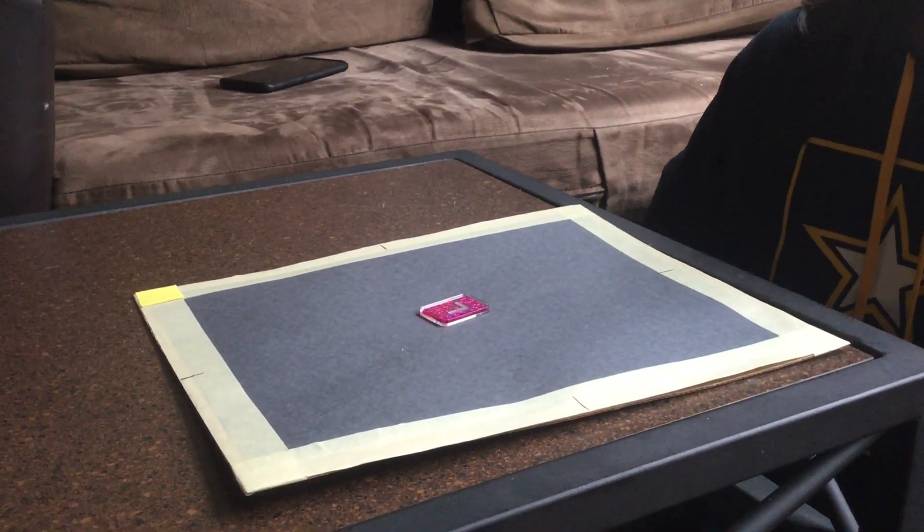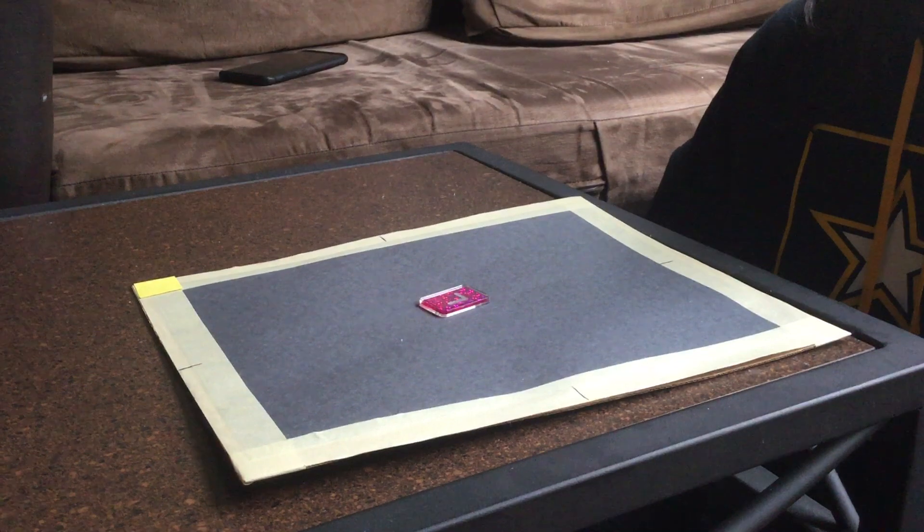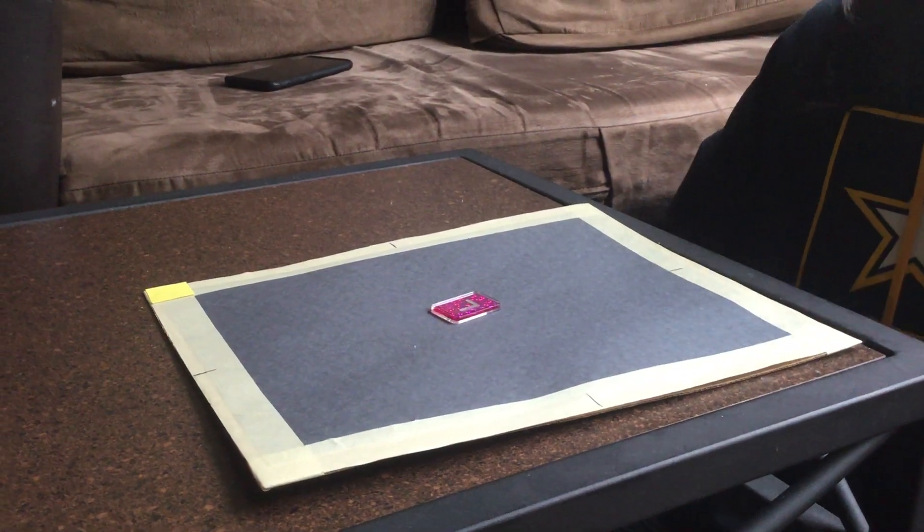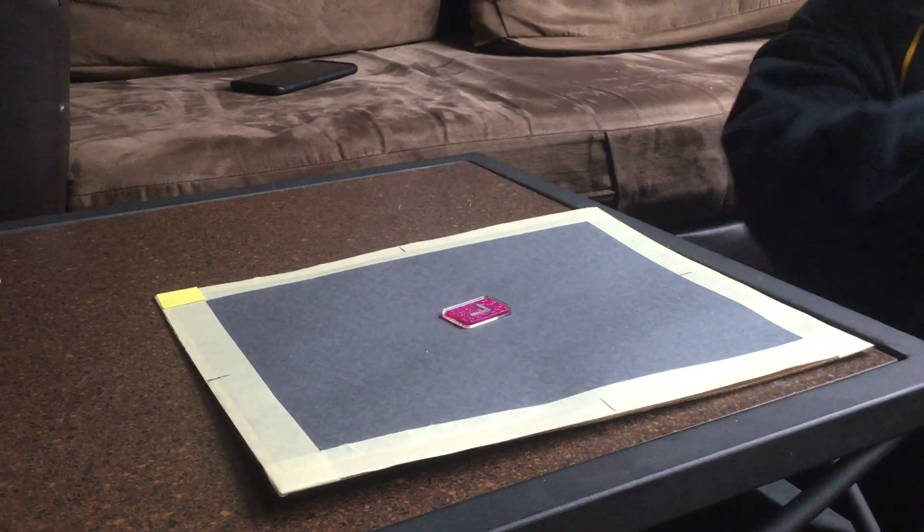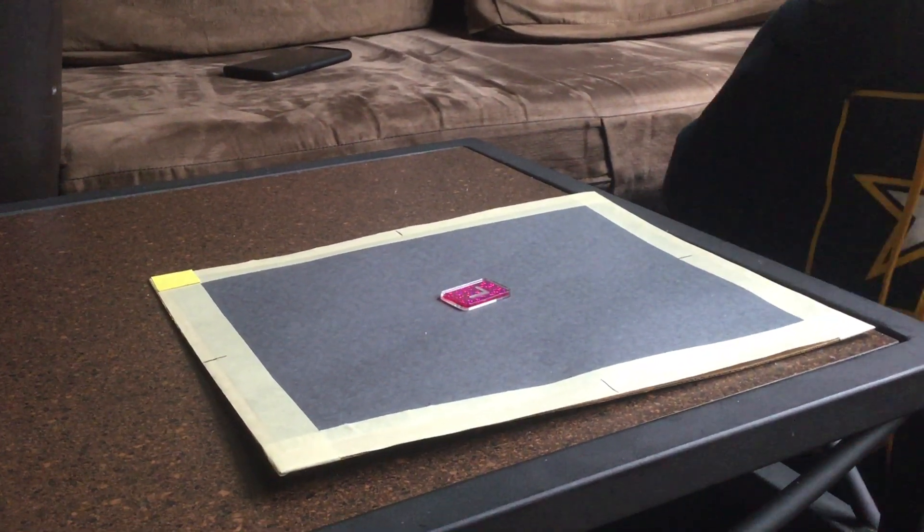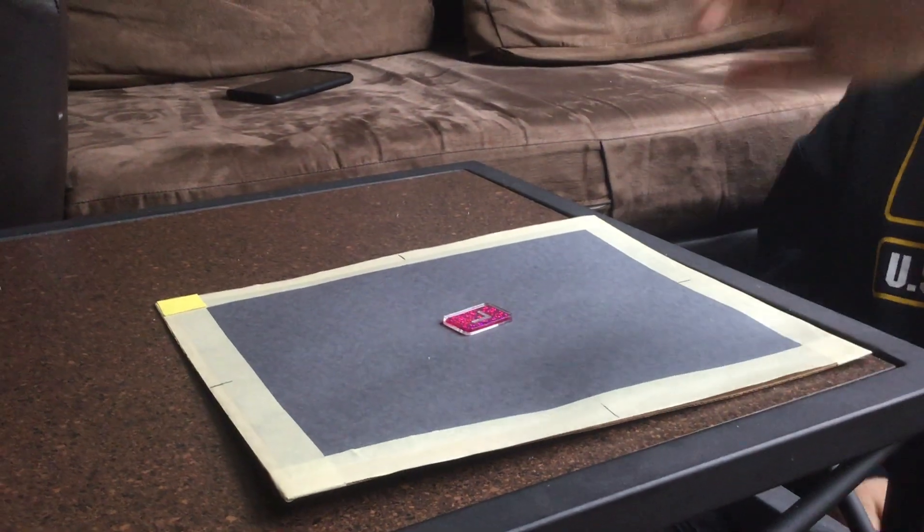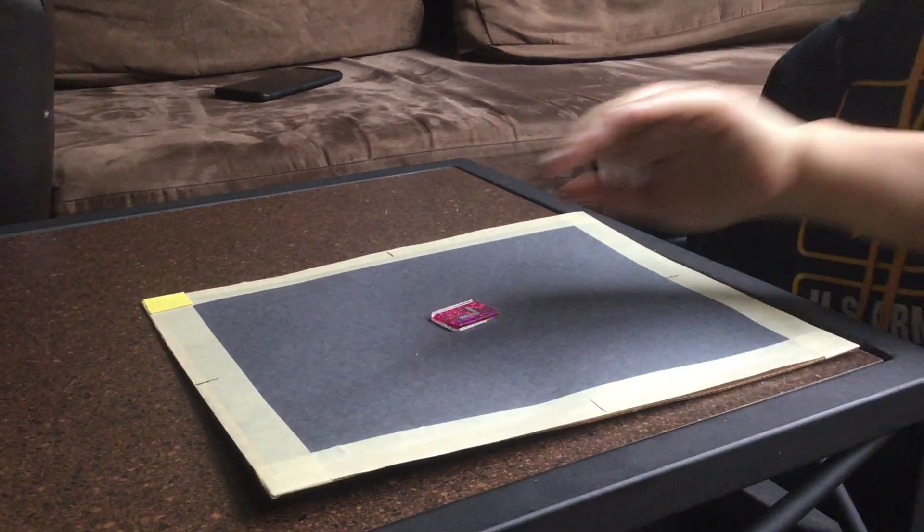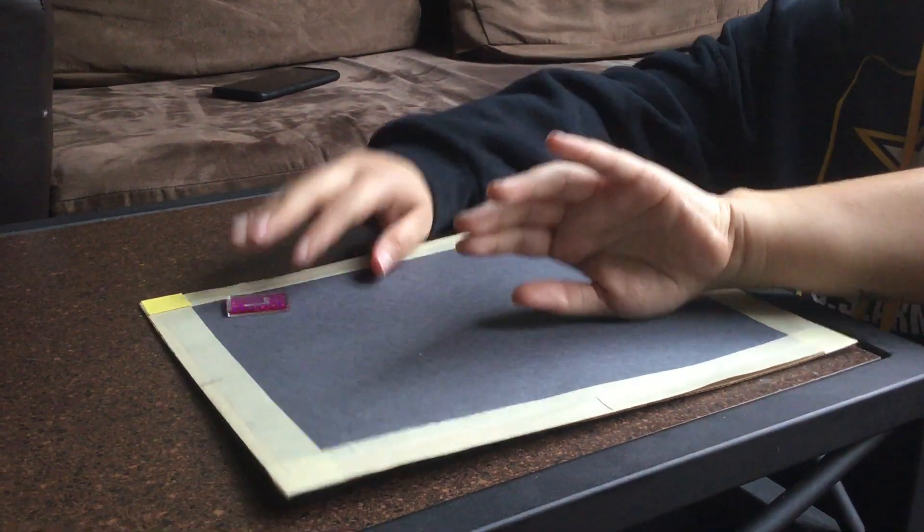So we're going to start with the PA, no, AP thumb. We're going to place the thumb like this.